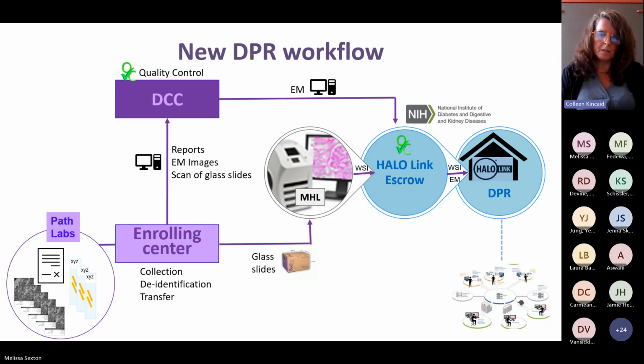Like, oh, don't include this one. Oh, wait, this one's crooked. Or, oh, wait, I can still see something through the label. You'll get all that feedback before you're allowed to actually ship the slides. So again, we're doing as much of the QC, pushing it as early as possible because it does actually save time.